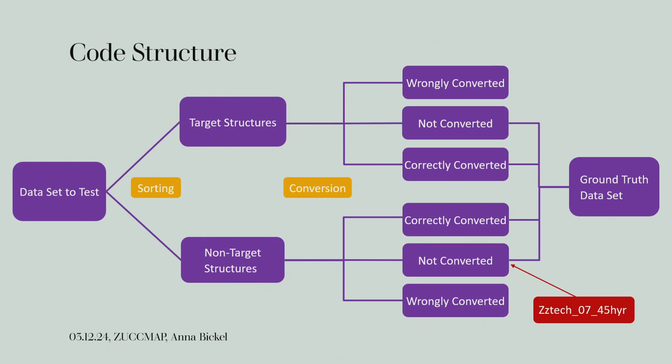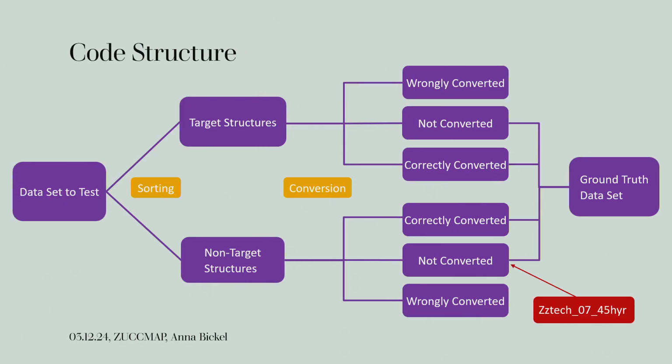But they were all a PTV expanded by 4 millimeters. That ground truth data set is quite big, and you just add new words when you add the correctly converted words, and the not converted words will also be added. There's just a list of not converted words, and if you want at a later stage to convert these names, you can easily find the ones which weren't converted.